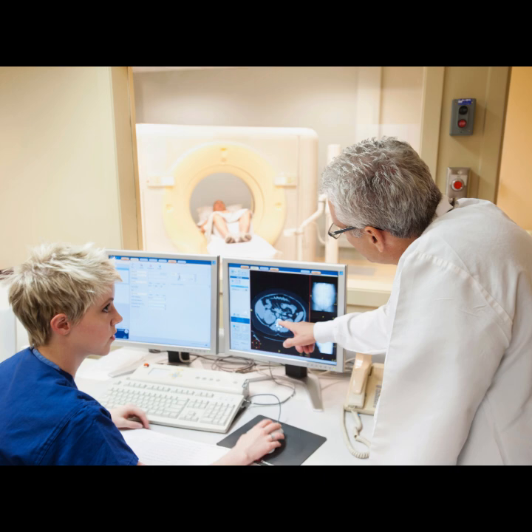It's the foundational physics. The position we trace in K-space is determined by integrating the strength and duration of those applied magnetic gradients over time. So what that means is the path is entirely determined by the waveform we actually feed the gradient coils. The receiver then just records the MR signal, which mathematically is the value of the Fourier transform of the object's spin density taken along that specific path. Precisely. We have, in theory, total control over the physical encoding mechanism.